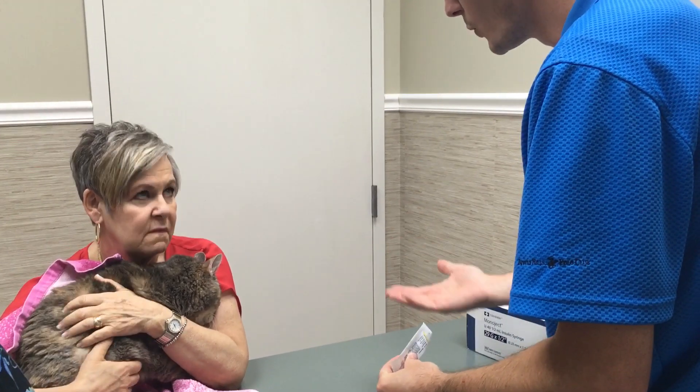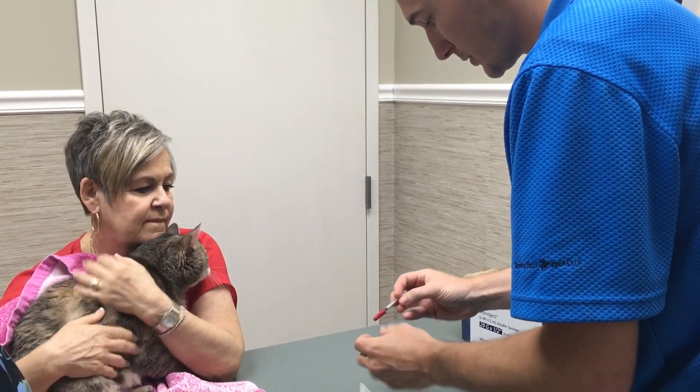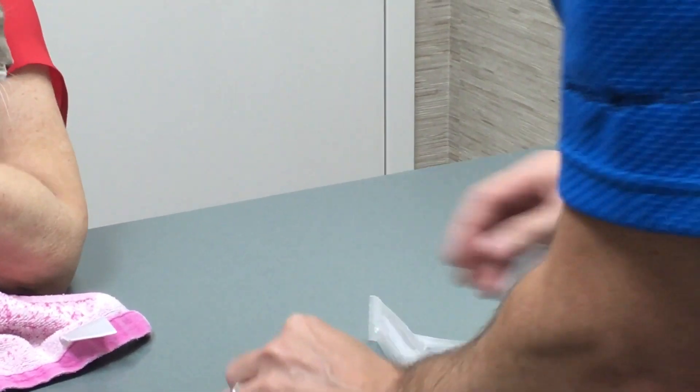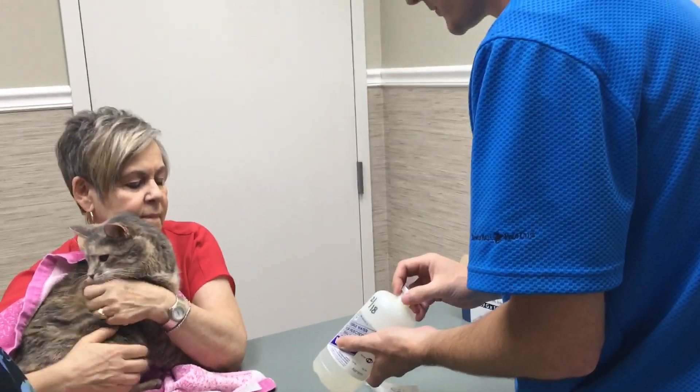So we are just going to draw one unit — just draw it with one little indicator, one mark on here, which is pretty clear to read. Just that first dash, so from 0 to 1 is all we need. So what I am going to have you do first is draw up some sterile water. I just want to watch you draw it up and make sure that goes okay.